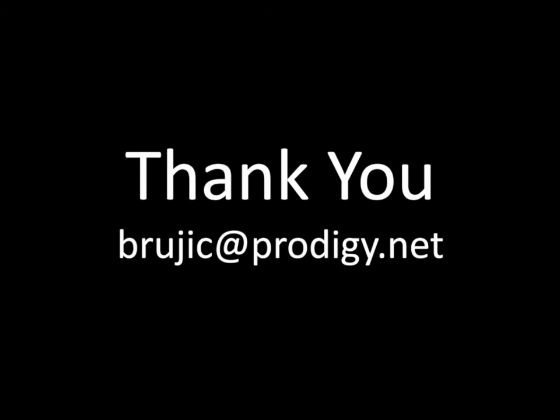For those that are current iView users, what you really want to make sure you're doing is having the patient fixate appropriately and where they're supposed to be fixating. One of the challenges we sometimes have are individuals with severe macular degeneration or a lot of macular scarring where they don't have a lot of fixation, or they may be severe macular degeneration and glaucoma patients and they don't have a lot of fixation, and we're trying to get optic nerve scans. So what you really need to do there is simply leverage outside tools and make sure you're moving their fixation points so that you're imaging the appropriate tissues at that point.